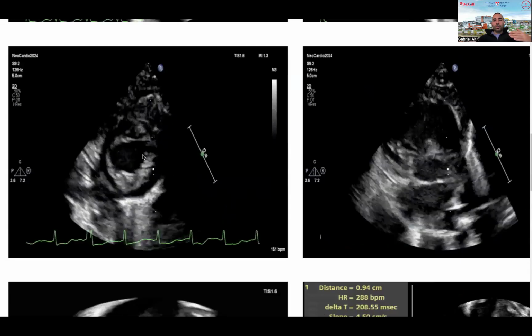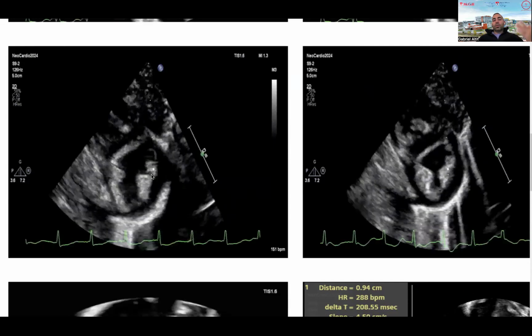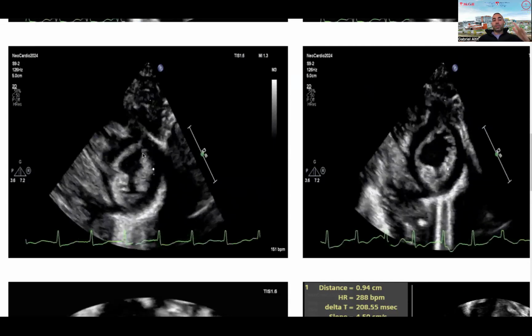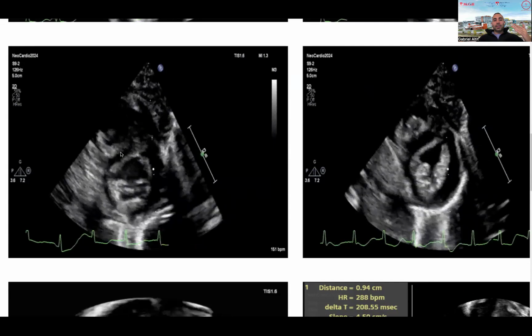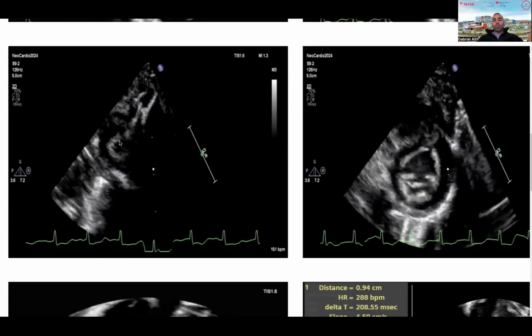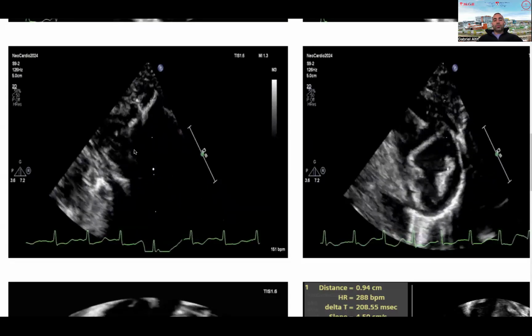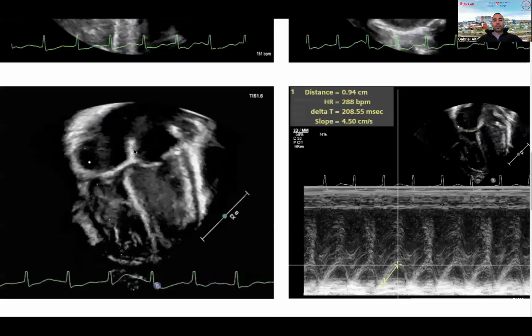And then we shift to the parasternal short axis view, where on the sweep, we can see that there's globally good contractility from the base to the apex of the LV. So it's important to look at every area of your LV to make sure there are no segmental issues in function. But we can also appreciate that in systole, and even potentially a bit in a portion of diastole, there's a bit of flattening, although it's more pronounced in systole, a bit of septal flattening at the mid-papillary level. And this tells me that the RV pressure is at least 2/3 systemic to isosystemic, so similar to the systemic compartment.